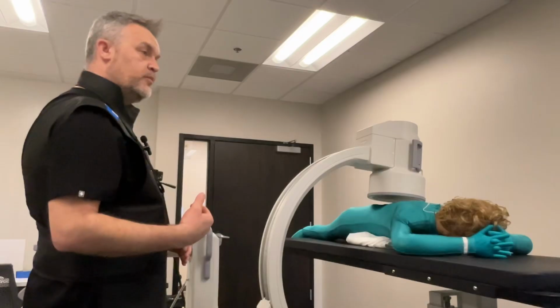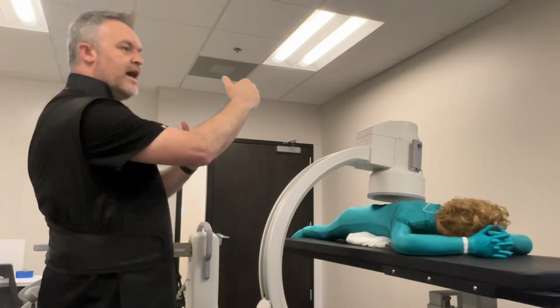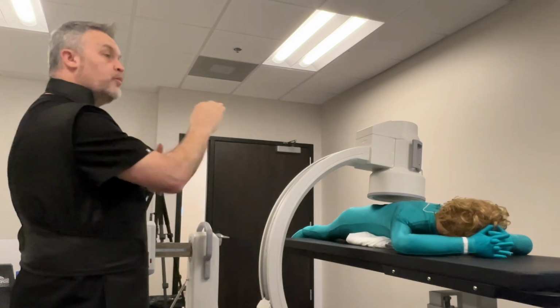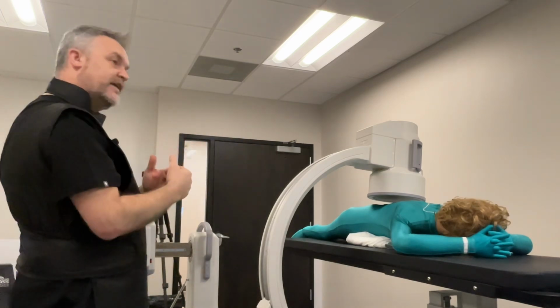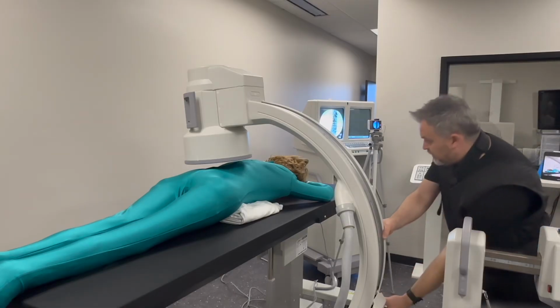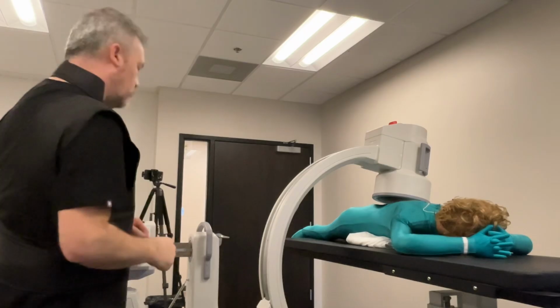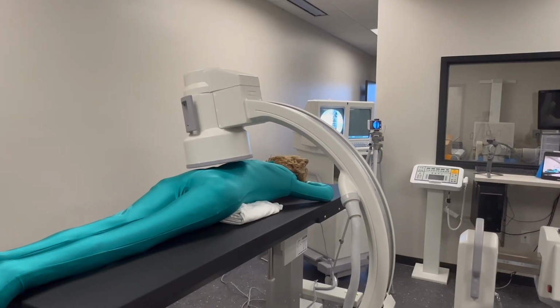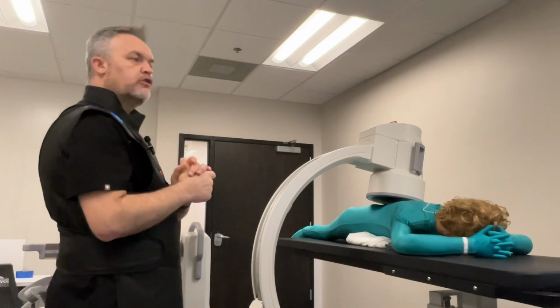So that's straightening them up, but again, because I'm below the fulcrum, you can see that when I apply the rotation, I am also moving the anatomy. So I have to add a little bit more overscan, and then I probably want to pull my boom back a little bit as well. So let's go ahead and apply a little bit more rotation, because the spinous process is still leaning a little bit towards the left. And now I will bring that boom back a little bit. Take that picture there. So now you can see your spinous process is much more centered, and here we're looking at L3.